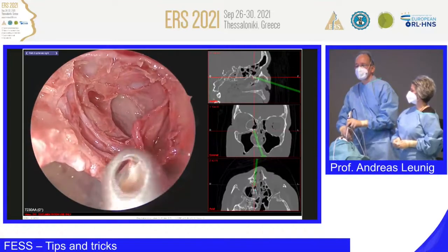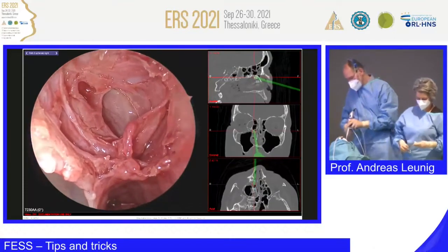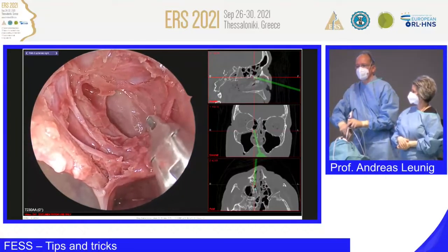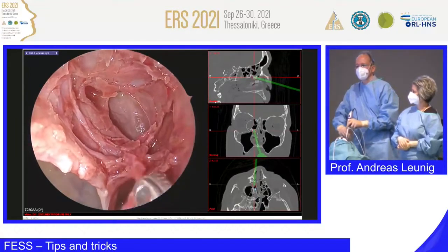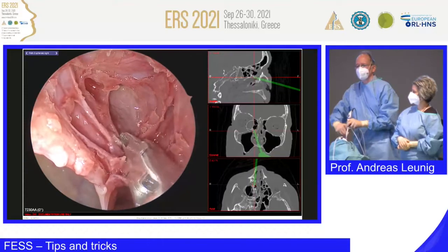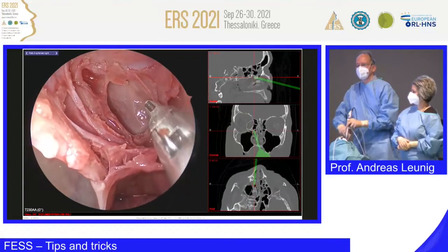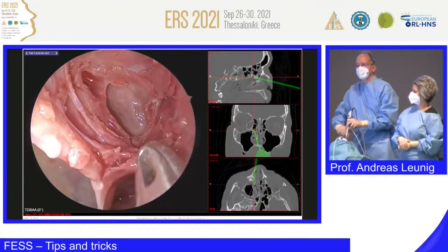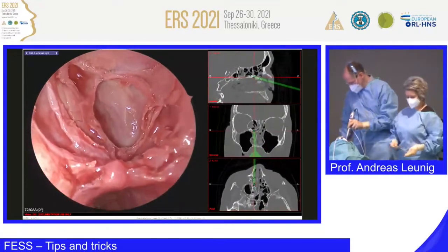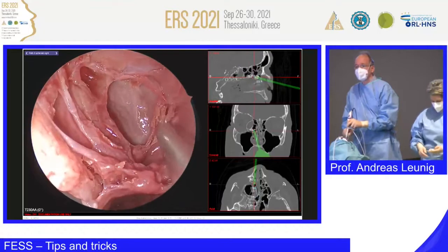Step by step, through cutting. I want to go very slowly. I don't want to rush, because you should understand the structures. I was looking for this structure. Maybe we are already touching the supraturbinate. Resecting the supraturbinate is usually not necessary. It depends, you can do it if there's an indication, and there are studies done by David Kennedy showing that olfaction is not really affected. So let's go in.